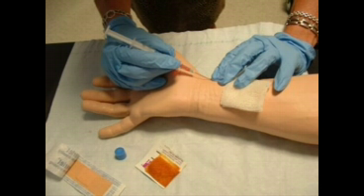Obtain the sample by inserting the needle into the skin at a 45 degree angle with the bevel up. Slowly advance the needle until a flash of blood is seen in the syringe hub. Stabilize the position and hold the syringe until the appropriate sample size has been drawn.